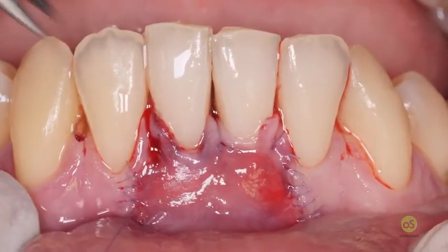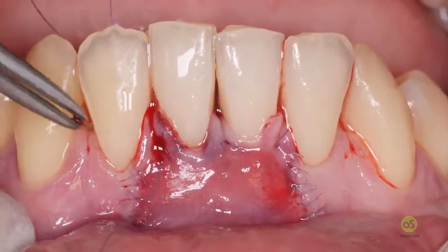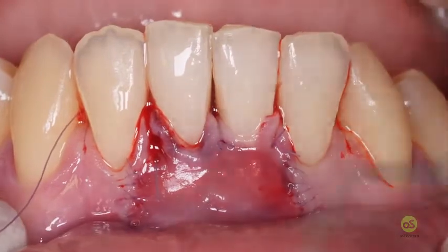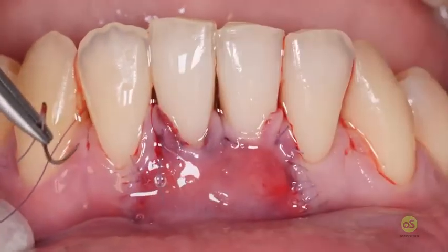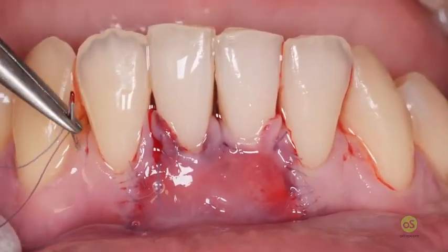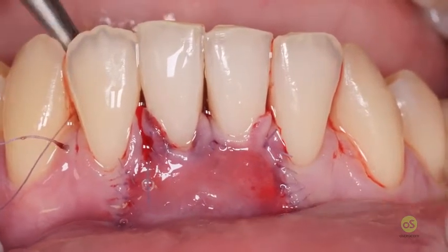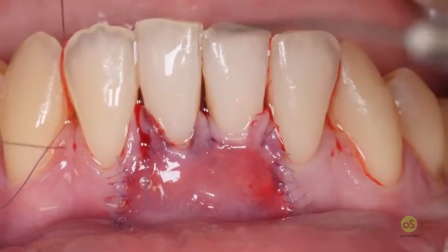Take anchorage distal. Remember that we did the other one a bit more mesial, because if I cut the same, I will be a bit angry for this.